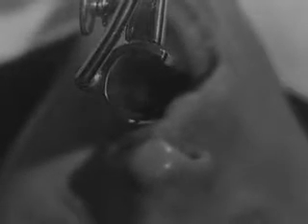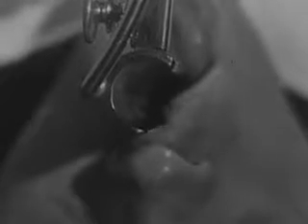The beginner will have to learn to recognize these landmarks as they appear to the anesthetist. We will now see what they look like through the laryngoscope. This is the uvula silhouetted against the wall of the pharynx. The bulb of the laryngoscope can be seen on the left. And here is a simplified drawing of this region.